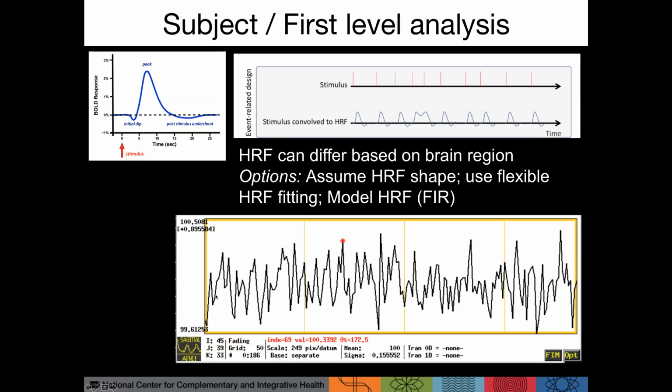So this is activity within a voxel over time. And what you see is that this is when we applied high heat stimulation to that subject in this box. So they had 4 trials of high heat. They also received medium temperatures and low temperatures, and the heat was on for 10 seconds. So basically this is a 10-second, what's called a boxcar. So it's basically like the stimulus stays on for a little while, convolved with an HRF that doesn't have an undershoot. And we can fit that to the brain activity along with a bunch of other regressors. And this is what we get ultimately as our best fitting response, having regressed out things like motion, nuisance covariates.